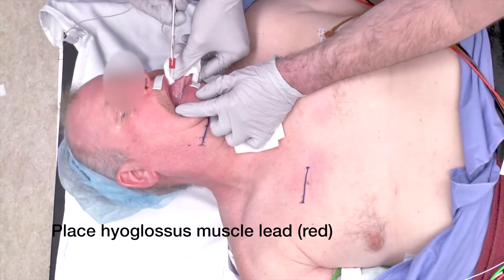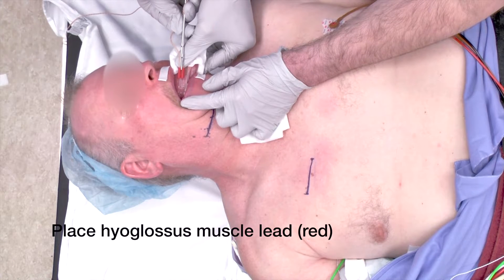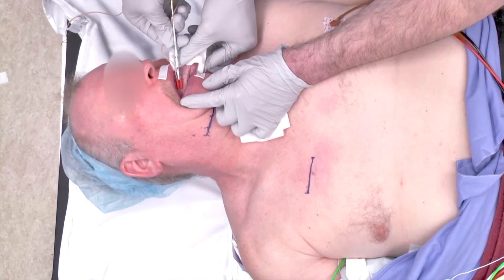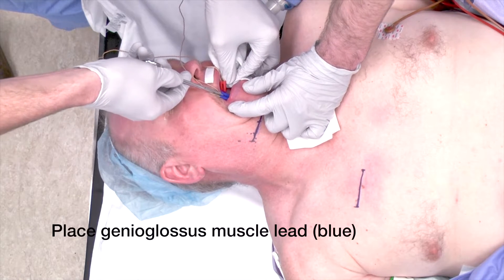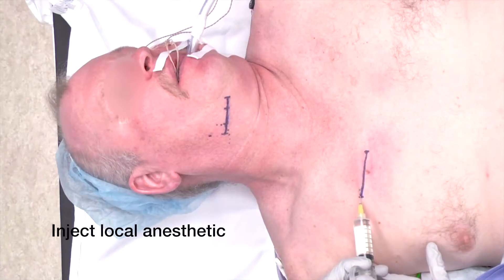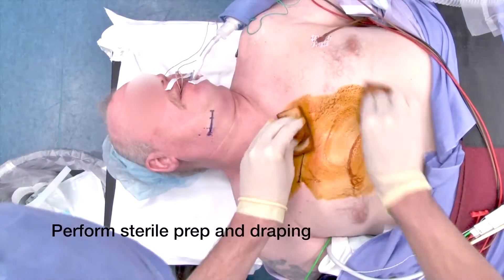The next step is placing electrodes in the tongue. The red electrode goes to the lateral tongue, which is placed very superficially to identify the hyoglossus and styloglossus muscles, and the blue lead goes to the genioglossus muscle, which is just in the floor of the mouth at the apex of the mandible. Incisions are injected with local anesthetic.